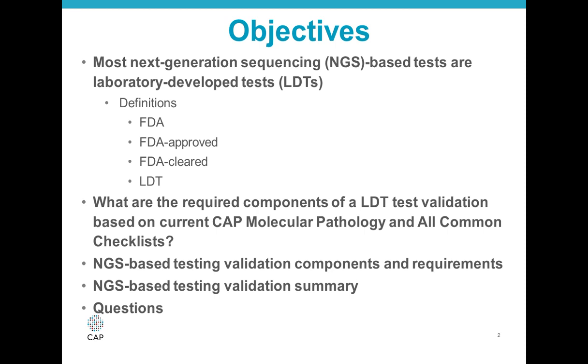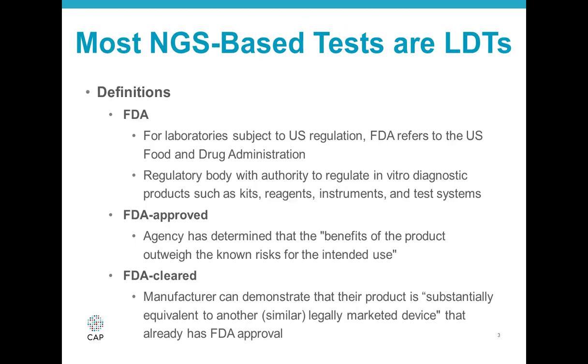So today we'll discuss the concept of laboratory-developed tests, or LDTs as they're known, which also requires some basic knowledge of the FDA and what it means to be FDA-approved and FDA-cleared. Today we'll also discuss the requirements of an LDT validation, next-generation sequencing-based testing validation components and requirements, as well as the concept of a next-generation sequencing-based validation summary, and then we'll also have some time for questions at the end of the presentation.